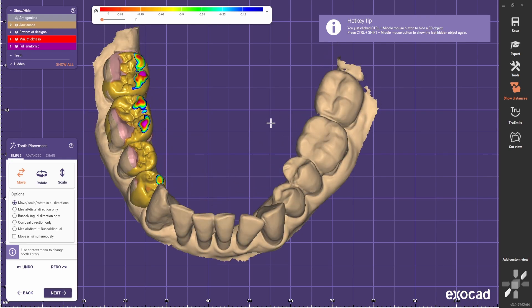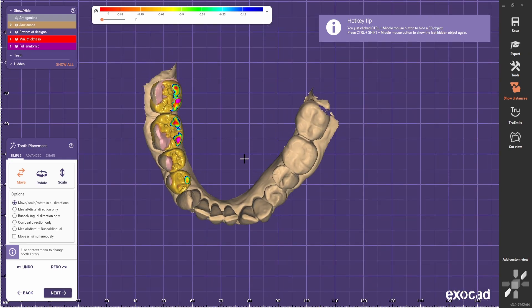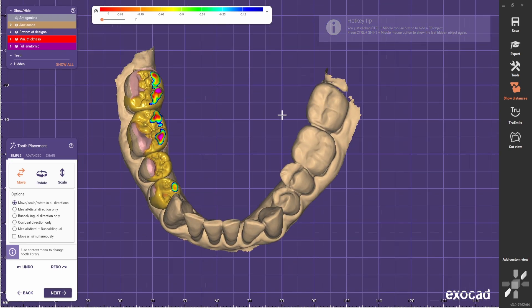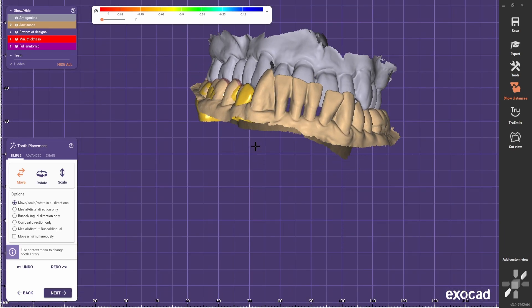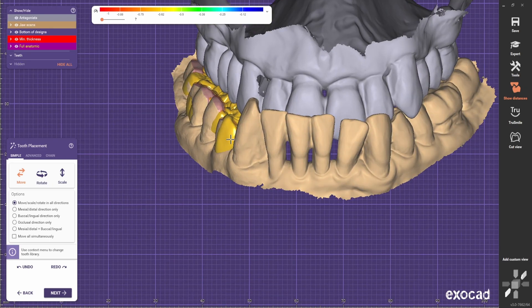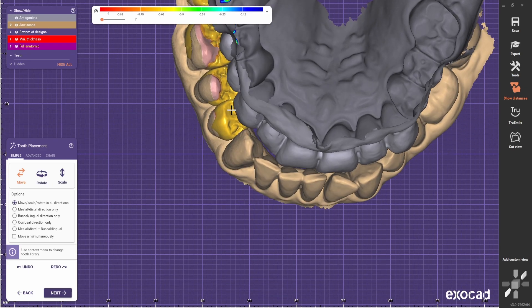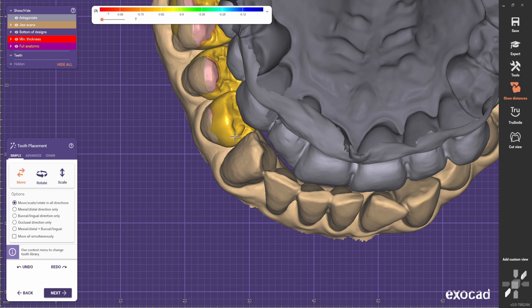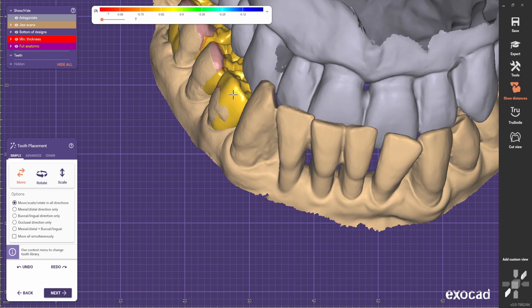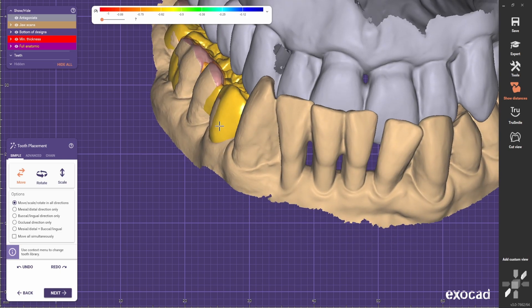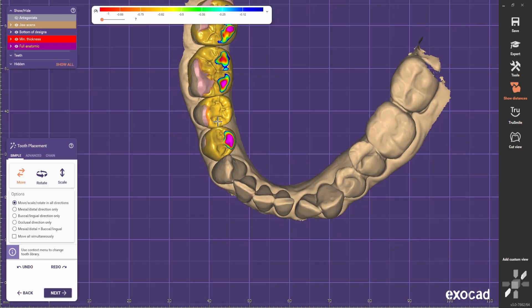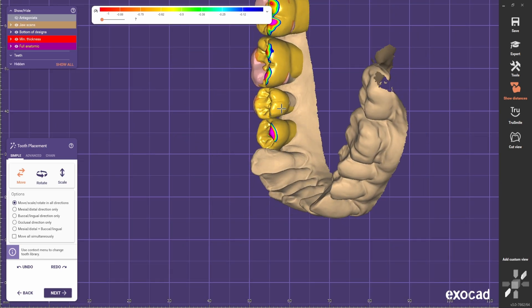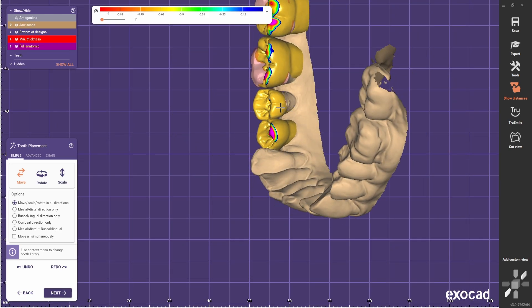Now we're going to use the generic library — not my favorite library, but I want to use this one and try to improve the morphology. I guess that most technicians that use Exocad use this library, so I like to give some examples on how you can improve the morphology of the generic library, and it's always a nice challenge to do so.